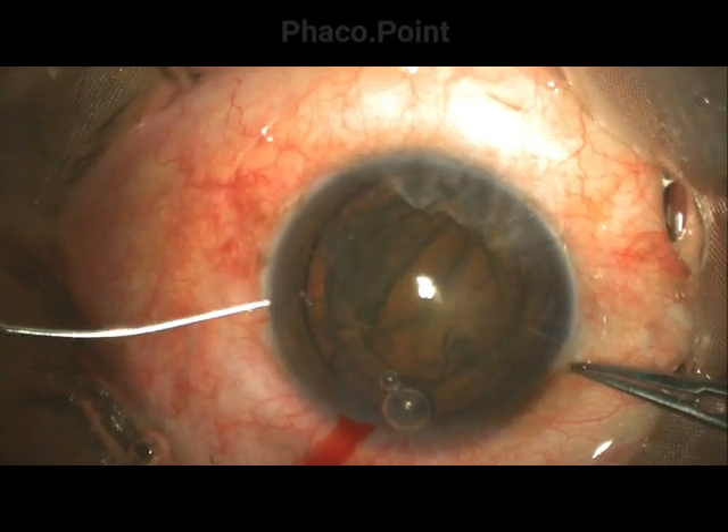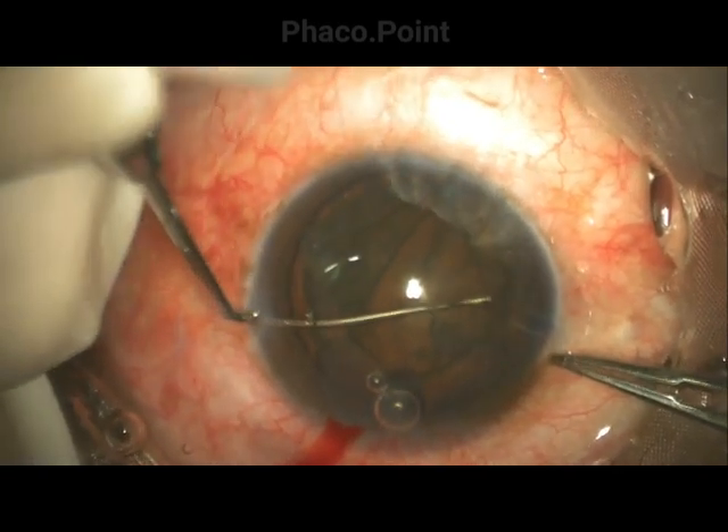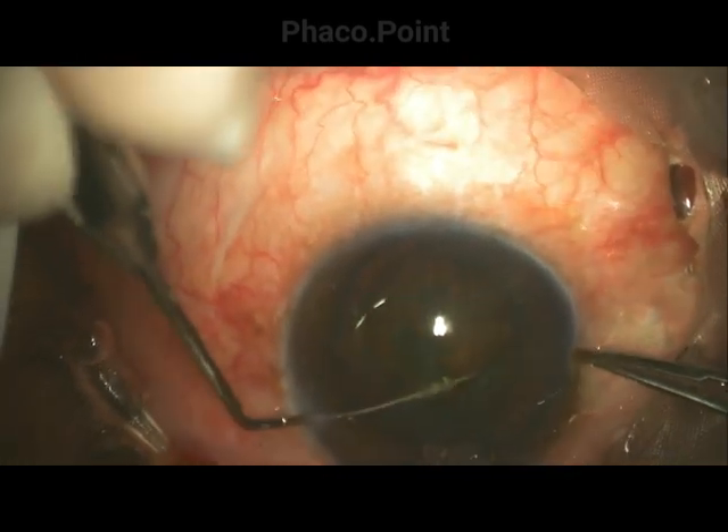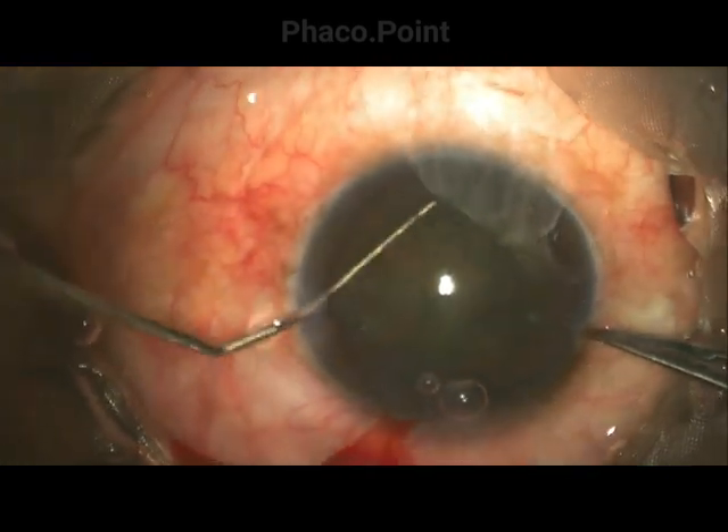The globe is stabilized with the limbal forceps, and then the Sinski hook is placed in the mid-periphery, held firmly, and turned through one complete 360-degree turn.